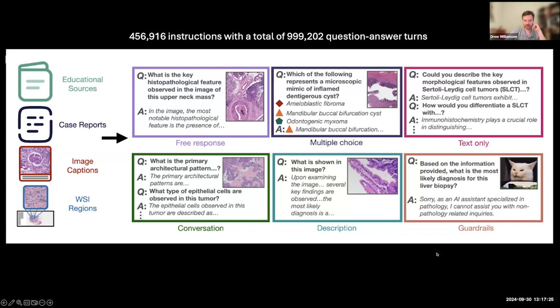I think a couple things interesting to me to point out is that we had to put in these kind of guardrails here where we didn't want our model to just respond to any question. And this is probably extremely important for these public-facing things like ChatGPT. I know OpenAI doesn't want to be liable for what ChatGPT says, so they spend a ton of time creating and developing these guardrail instructions used to train the model to, in our case, say, this is the model trained for pathology, so if you give it an image of a cat, it's not going to respond to that.